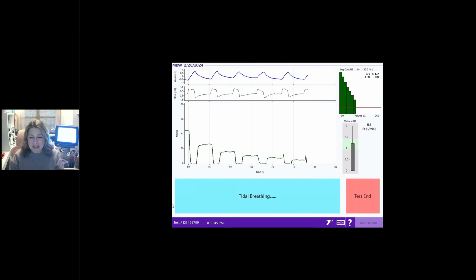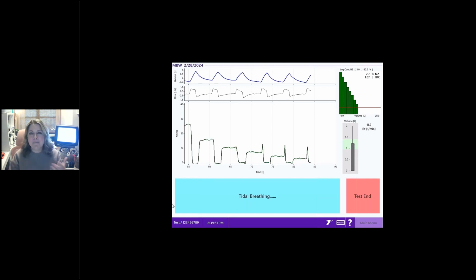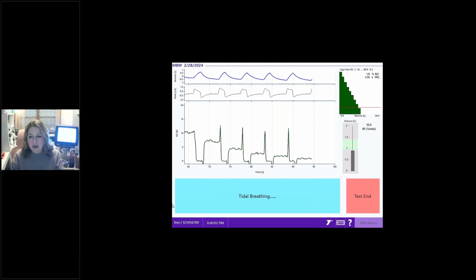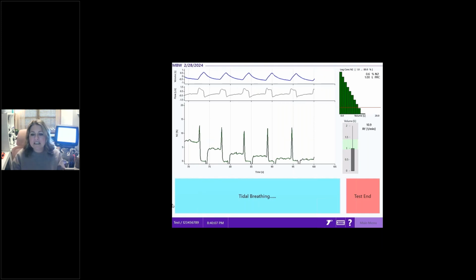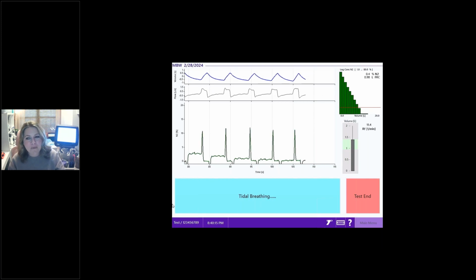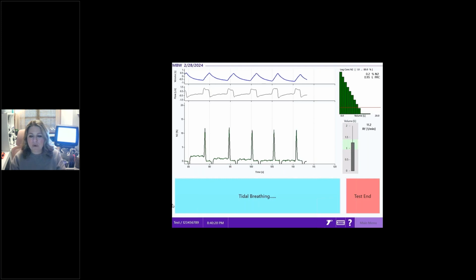They will feel like you are repeating the same thing over and over again, but this really is as simple, in quotes, as this test is. It's normal breathing. We think, oh, it's just normal breathing. We can get through it quickly. Coaching them through, guiding the test from the beginning to the end really is going to set you up for much more success than trusting that they can normal breathe at a steady pace on their own. So you'll see that's breath 4 underneath that red 2.5% line. And then we're going to have one more breath before it clicks us over to that test results screen.